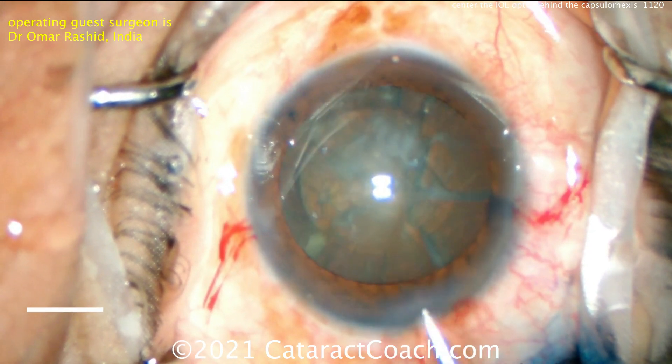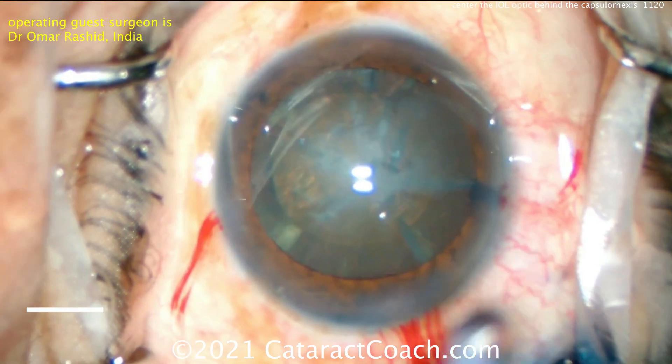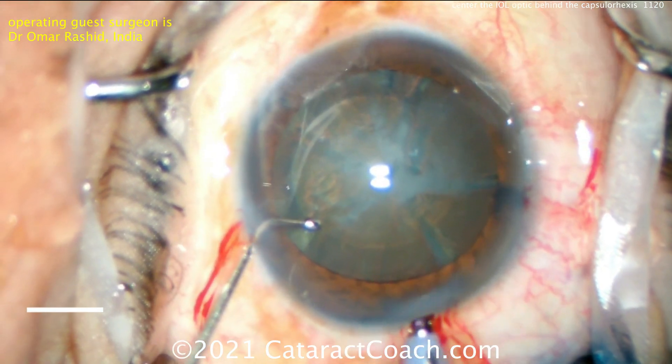A little good hydrodissection here, and a little bit more HPMC. The HPMC is very inexpensive — you can use a lot of it. These are often coming in one cc syringes, so quite a good volume.